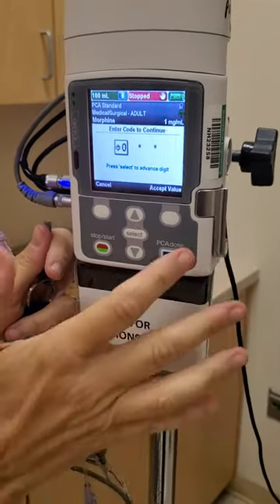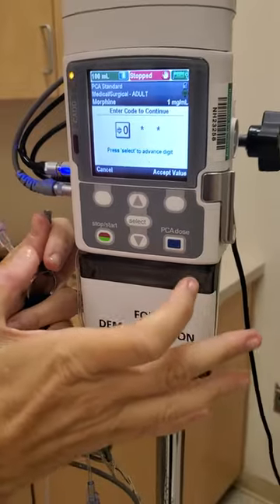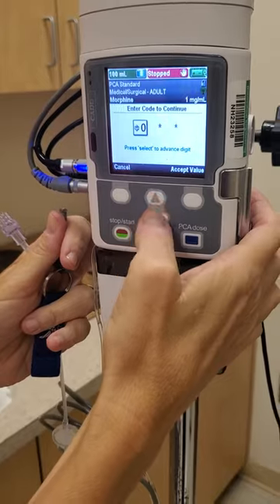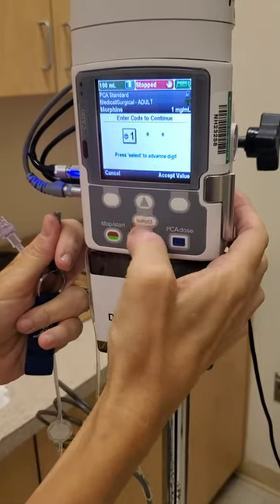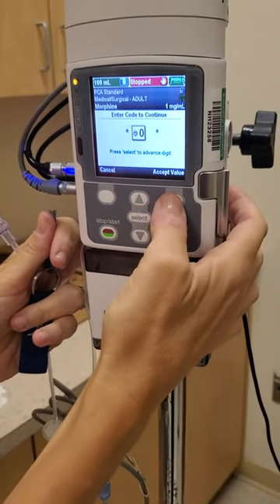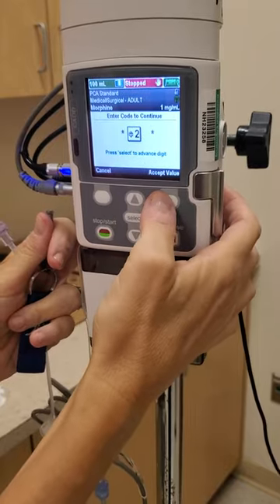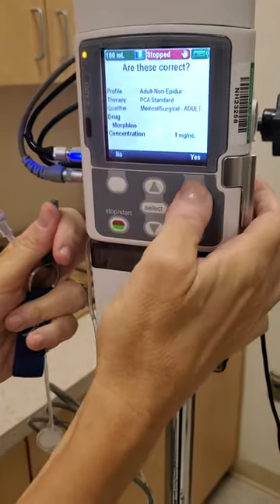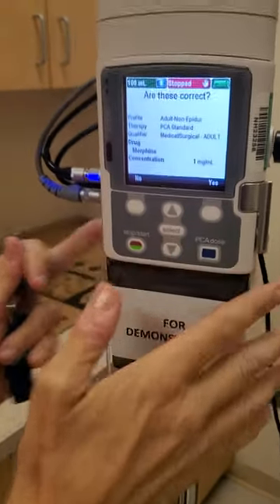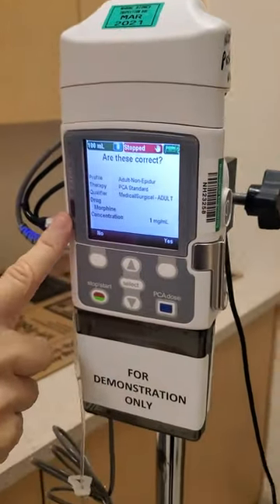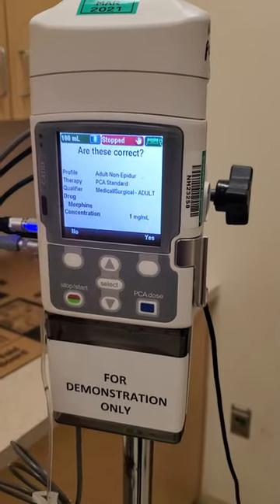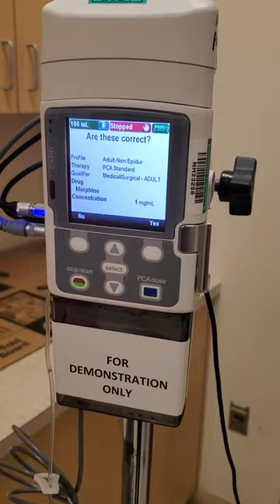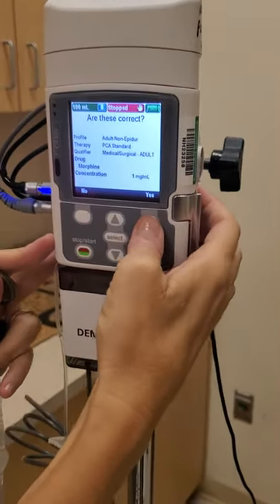Next, I'm going to enter the code to allow me to set up the pump. The number is one, two, three — so I'll put one and accept the value, then three and accept the value. It's then asking me to confirm that I've selected the appropriate things as a double check. I've selected my drug from my order, and I'm going to answer yes.